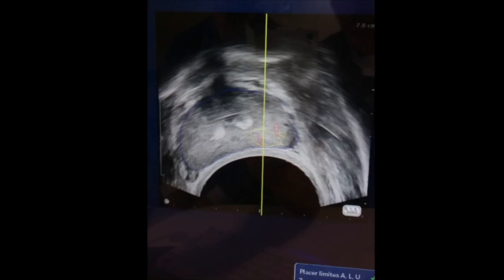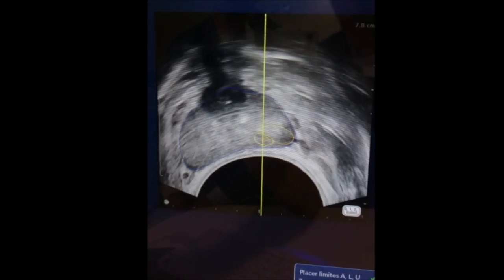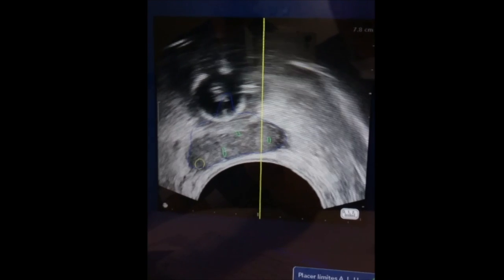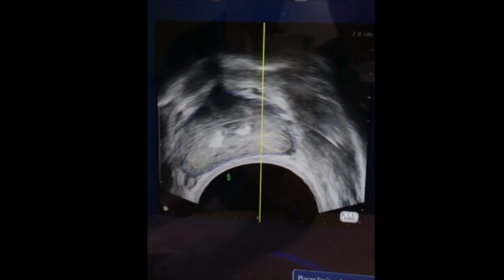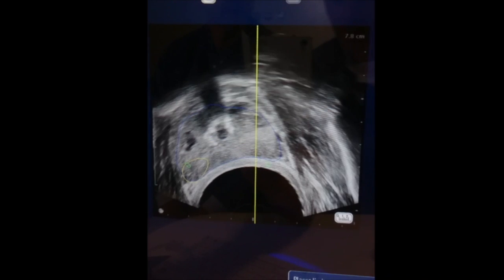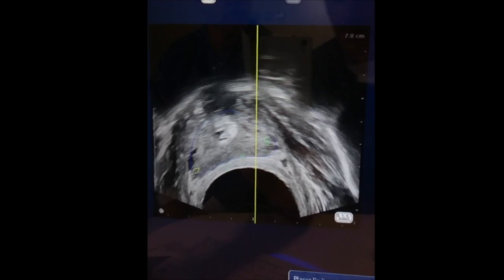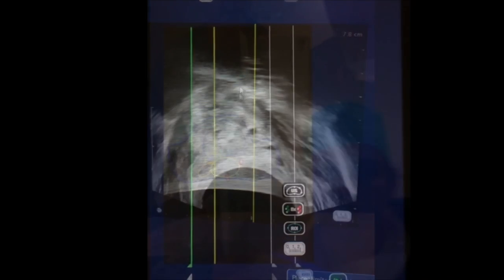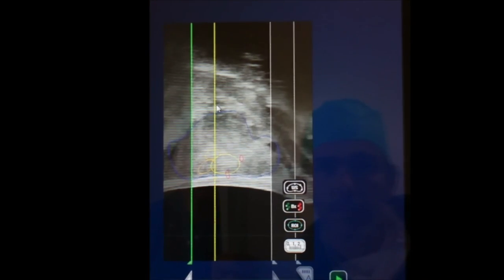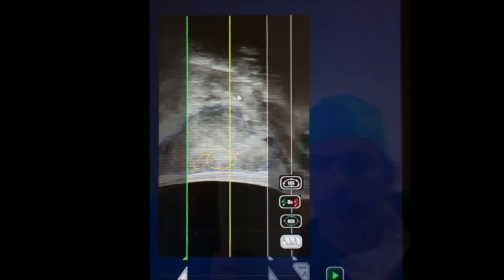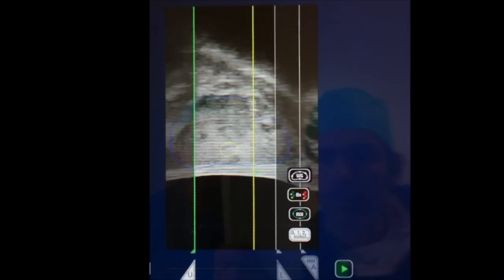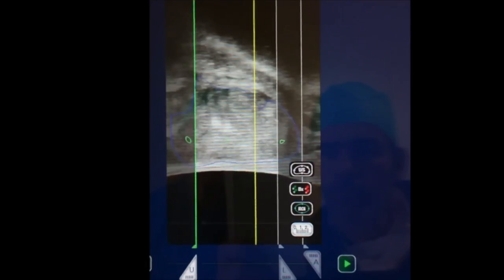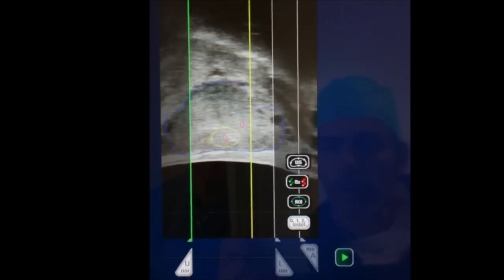This fusion allows projecting the target and the positive biopsy during the HIFU treatment, in order to help the visualization of the future target. This is very important to determine the limit to the apex and to the base of the prostate. We usually use a 9mm margin around the MRI target according to LUNOBIN studies.